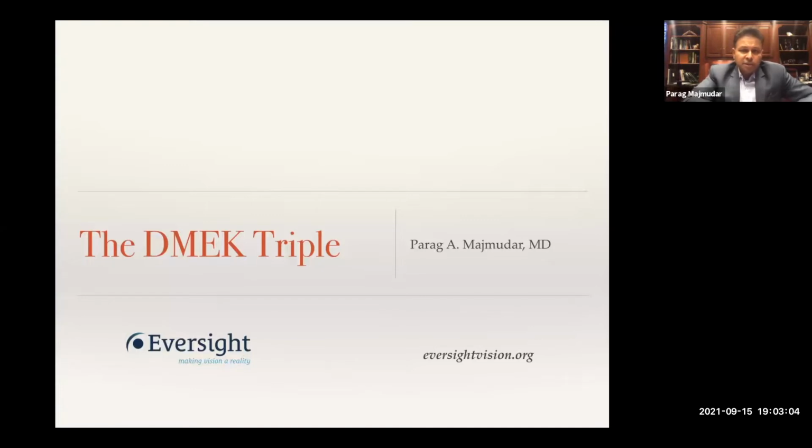But today they've asked me to talk about a concept where there's sometimes a little bit of uncertainty in terms of how to proceed. And that's when we have to combine DMEK surgery with cataract surgery. I am going to talk for about half an hour or so. We'll give you some ideas, tips, pearls. I'm going to go through a basically unedited video of a procedure, and I can highlight some areas where I think it might be helpful to make the transition from doing purely DMEK to doing DMEK plus cataract surgery.